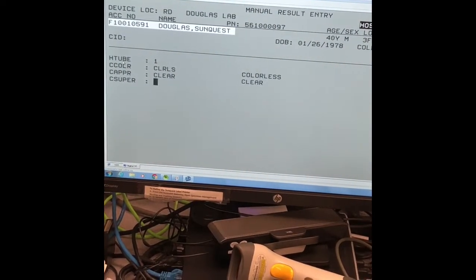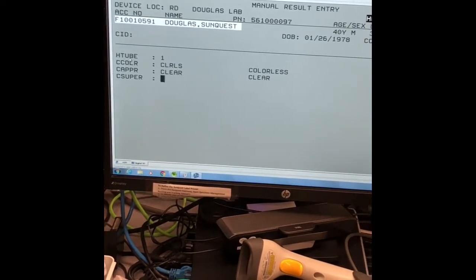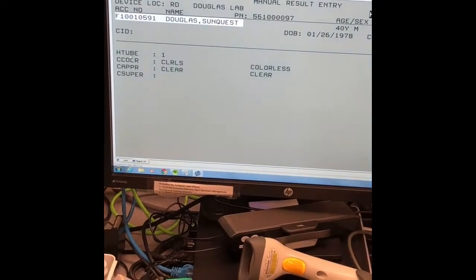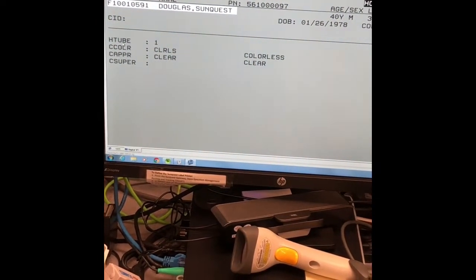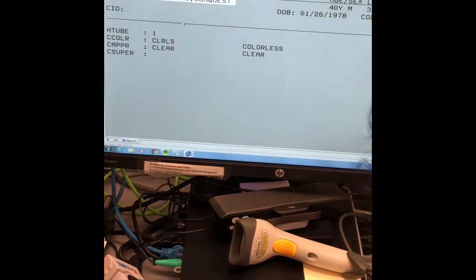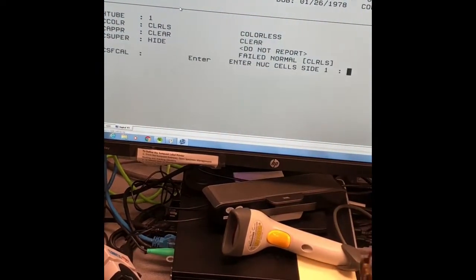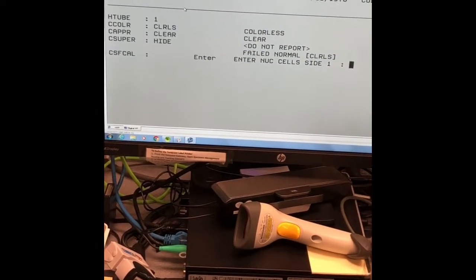And if it's a little kid or an infant, you may end up doing just one for doctor request. Most of the time, we follow that. Does that make sense? Okay, so for this one, we just 5. And that's what we're going to begin with, our WBC.